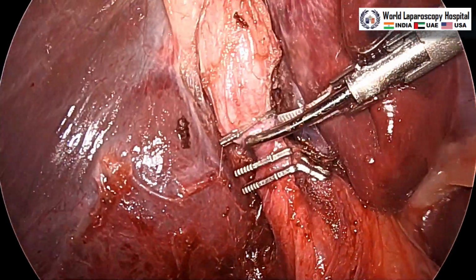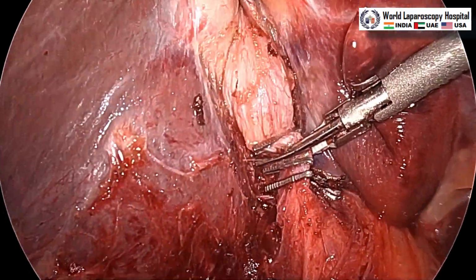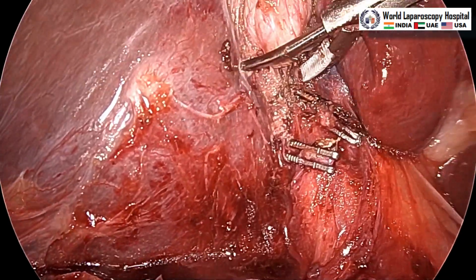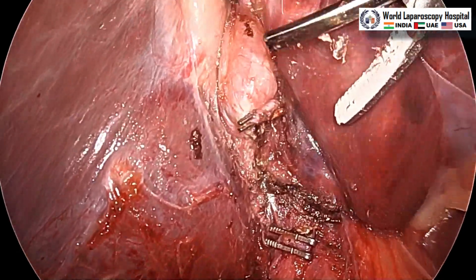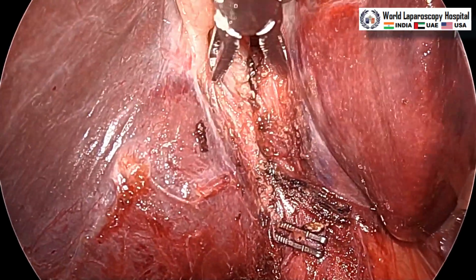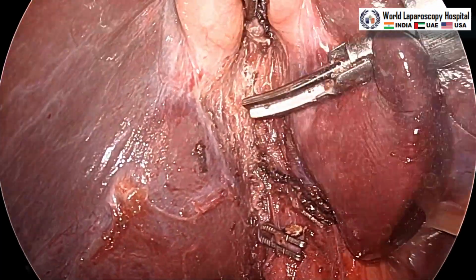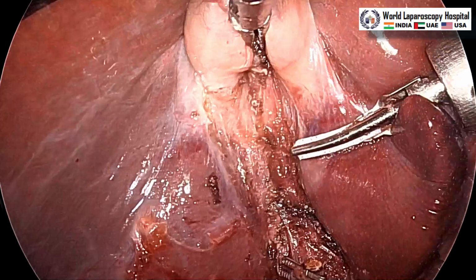And now this is the duct which is cut. Again, little relaxation is good so that it will seal. Now we can again hold the Hartmann pouch with the left hand, and then anteromedial, anterolateral traction will be given, and a good areolar plane should be achieved, and slowly the gallbladder will be separated from the liver.